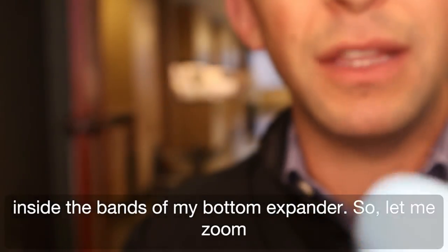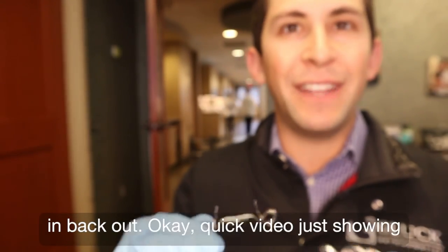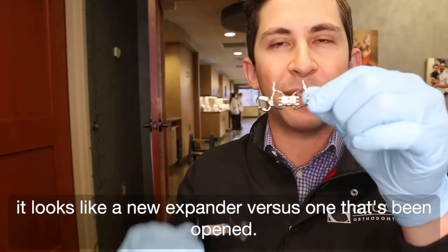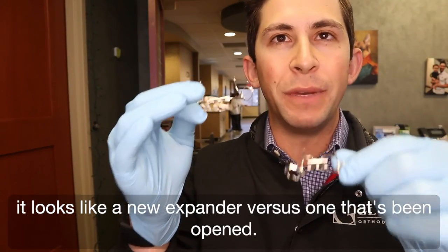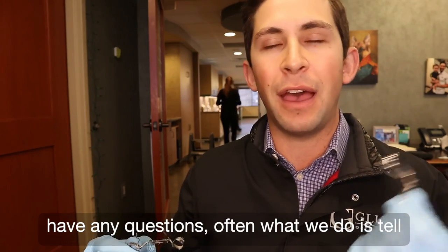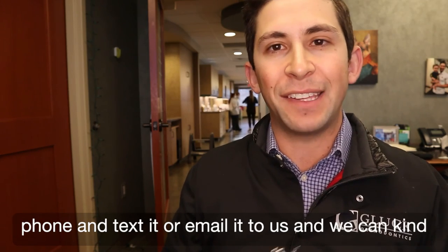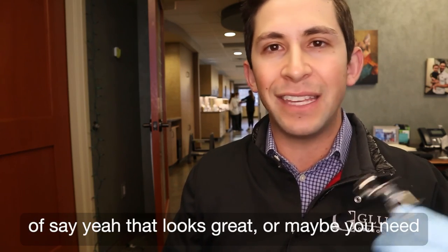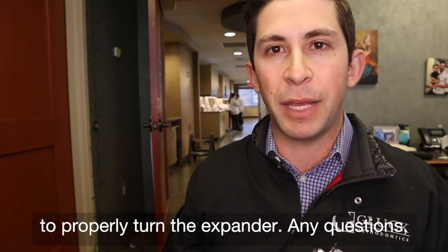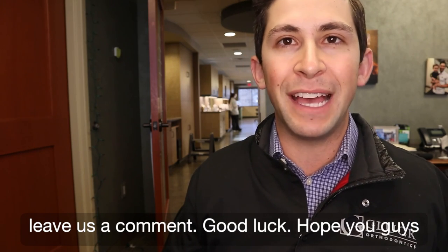Let me zoom back out. Quick video just showing you how to turn your expander and also what it looks like — a new expander versus one that's been opened. It's a really good key to keep an eye on. If you have any questions, often what we do is tell our patients to just snap a photo with their phone and text or email it to us. And we can say, yeah, that looks great — or maybe you need to come in and let's do a little coaching on how to properly turn the expander. Any questions, leave us a comment. Good luck. Hope you guys have a great day. Thanks.